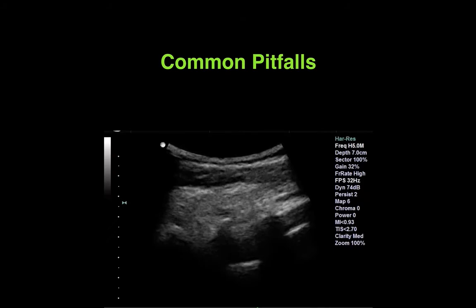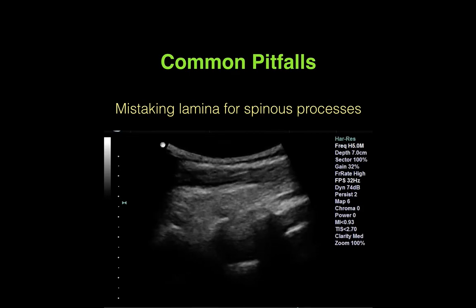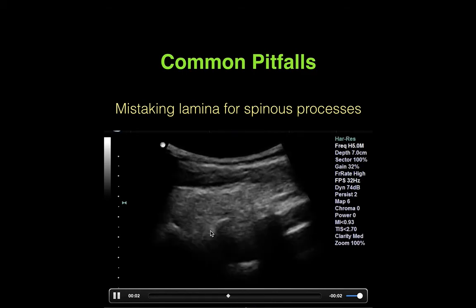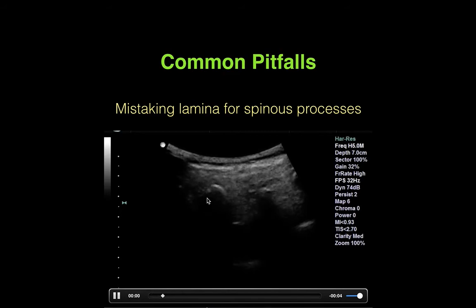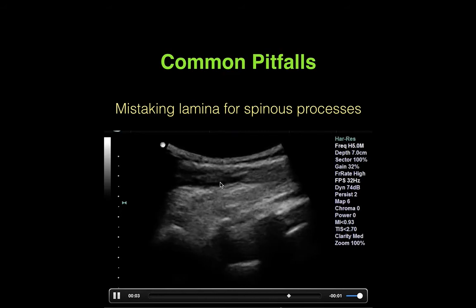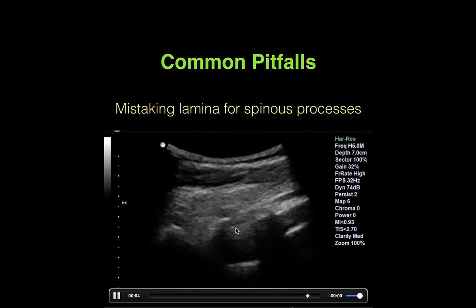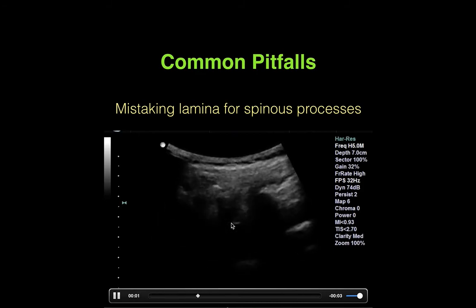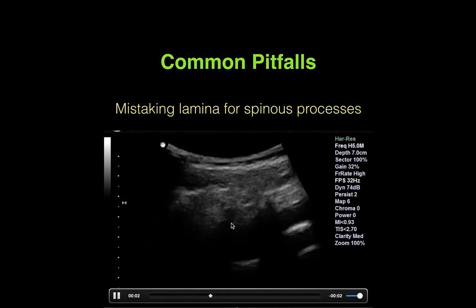One of the common pitfalls is people mistaking the lamina for spinous processes. It's actually quite easy to mistake those hyperechoic areas as spinous processes, because there is some shadowing distal to them. But if you sweep through more thoroughly and carefully, you'll realize that the spinous processes are actually a lot more superficial. If you make that mistake, not only is your midline off-centered, but your distances are also going to be very much mistaken. So take the time to really scan through the structure so you know what you're looking at.